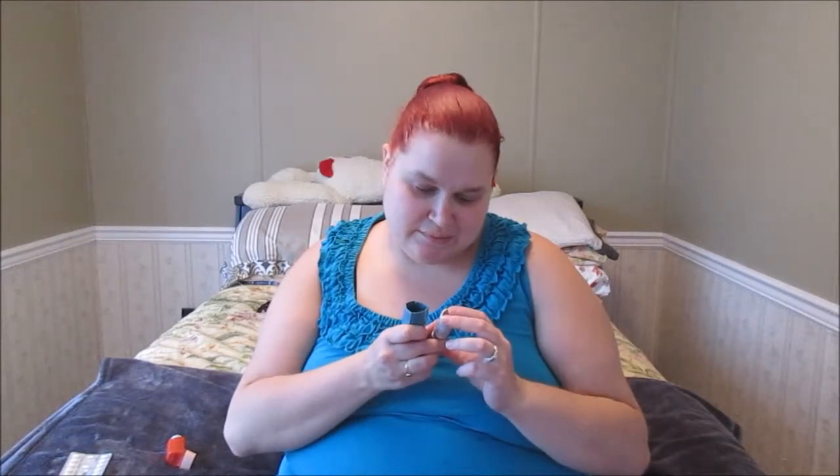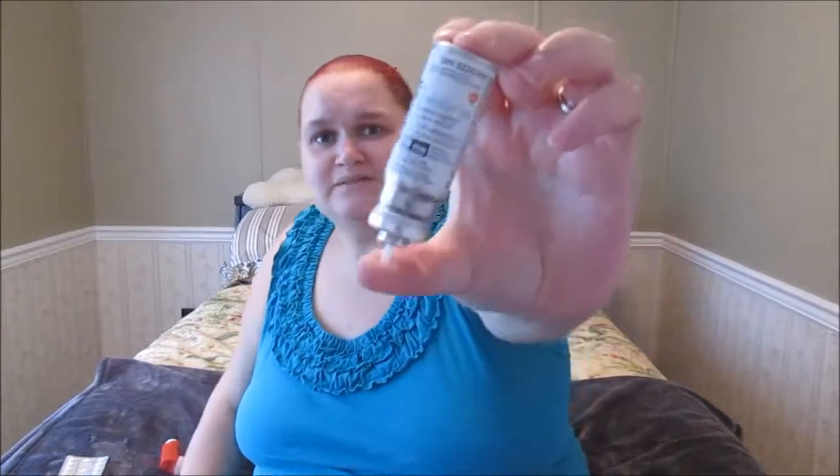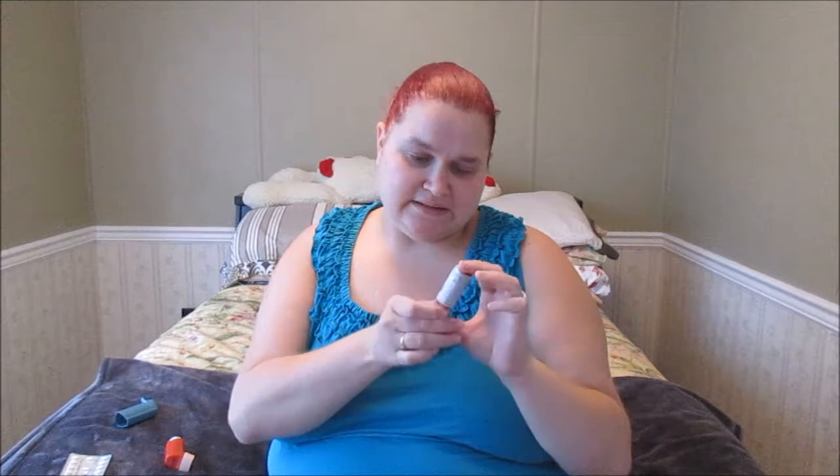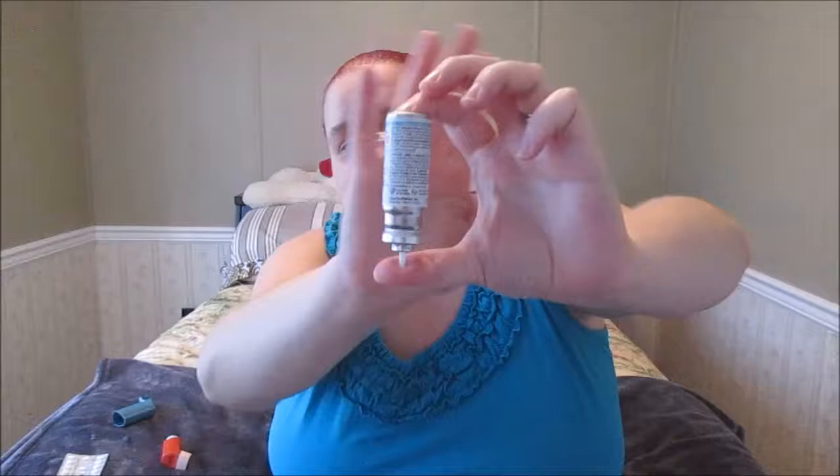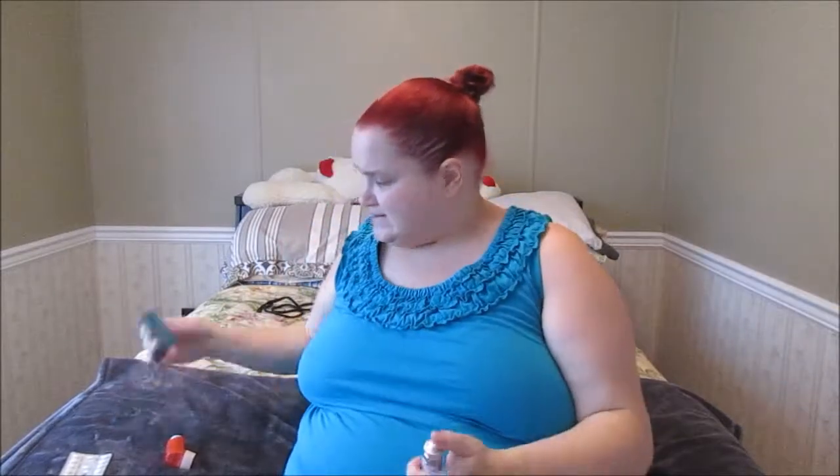I am on Ventolin — it's the salbutamol sulfate inhalation aerosol, the Ventolin HFA. This is my rescue puffer and it comes in a little metal canister. It's a bronchodilator and it comes in 200 doses.